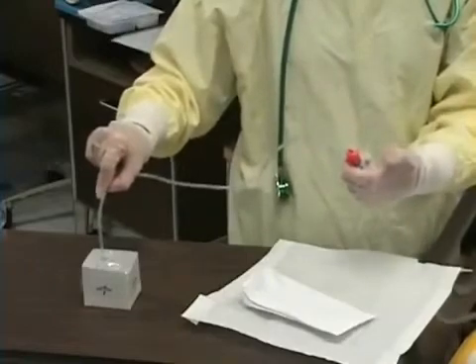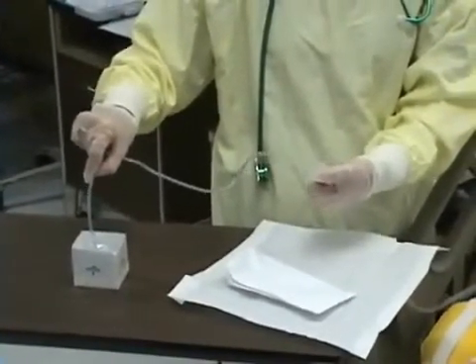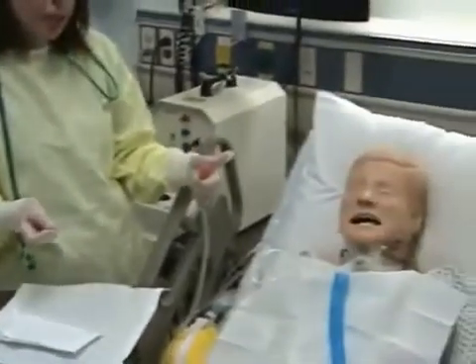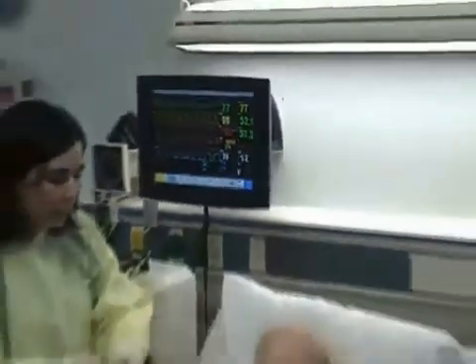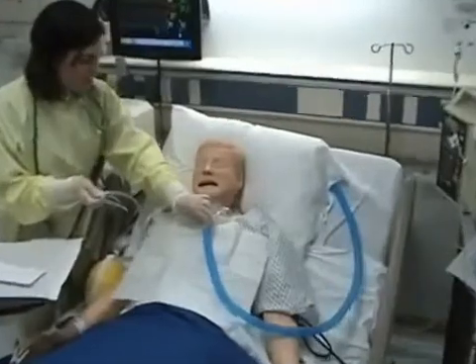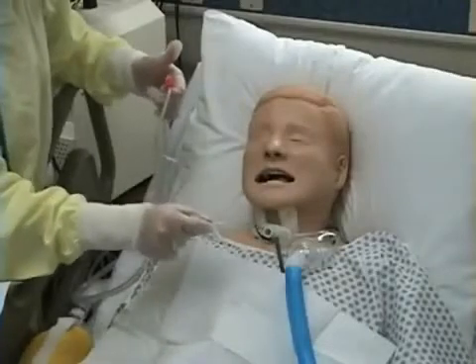With the thumb of my non-dominant hand, I will cover the opening of the suction catheter, and that is what applies the suction. I'm ready to suction. Again, I'm checking my patient before I start suctioning, noting their respiratory rate and pulse oximetry. With my non-dominant hand, I will move the trach collar to the side. With my dominant sterile hand, I now insert my suction catheter into my patient.